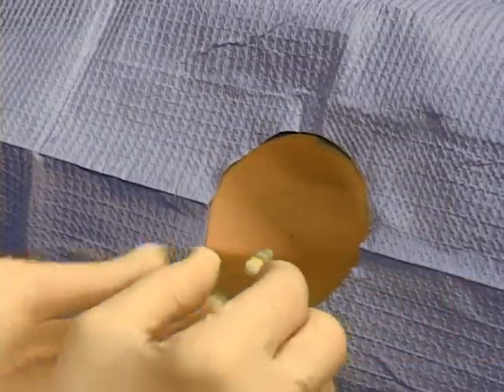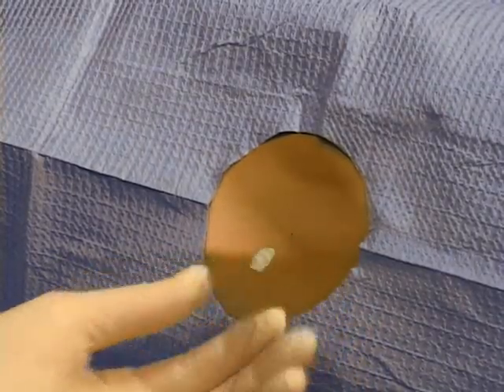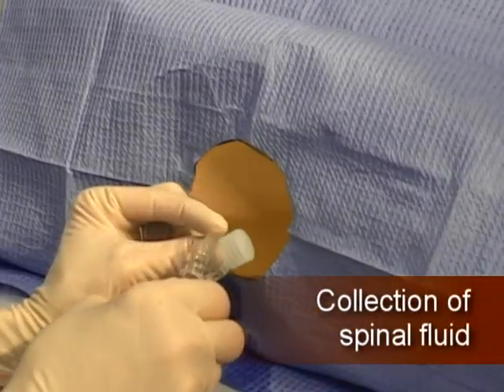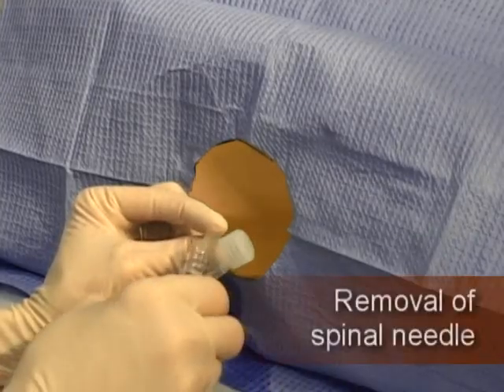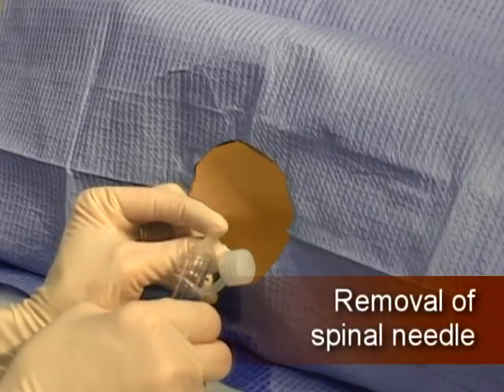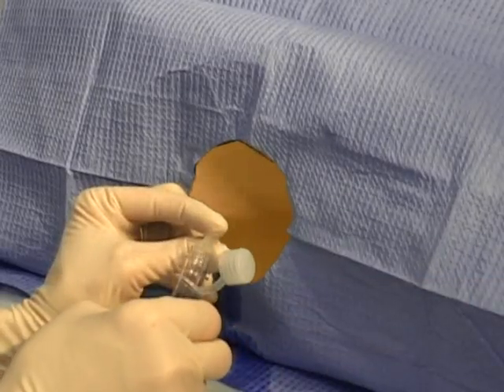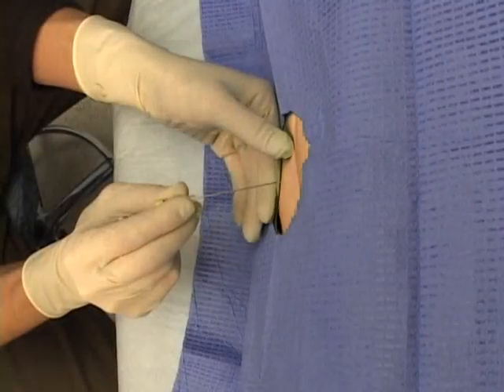Once the canal is entered, remove the obturator and allow the spinal fluid to flow out into the collection tube. In some instances, gentle rotation of the needle improves cerebrospinal fluid flow. Normally, collect 3 to 4 tubes with 1 to 3 cc's of fluid and label sequentially for cerebrospinal fluid studies.